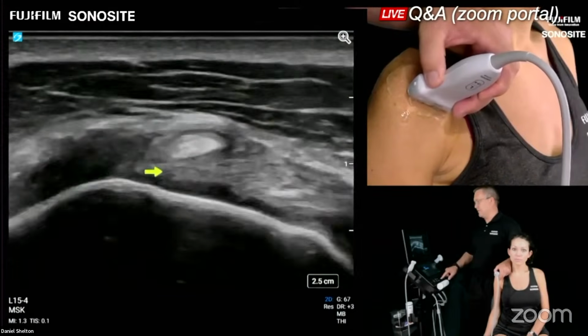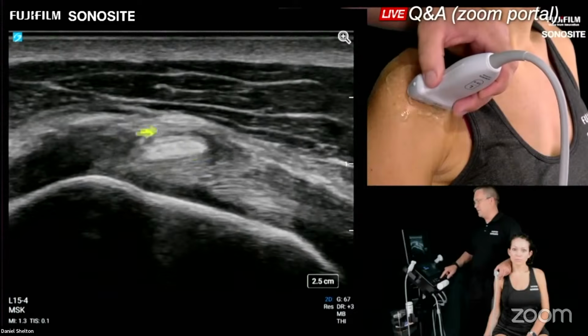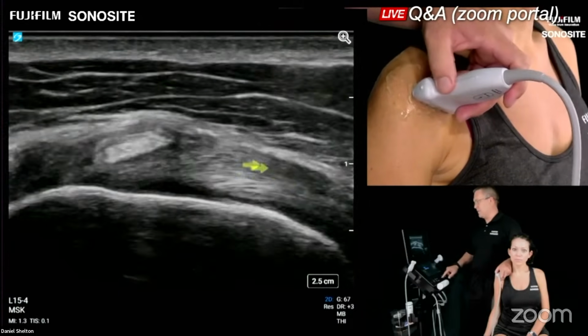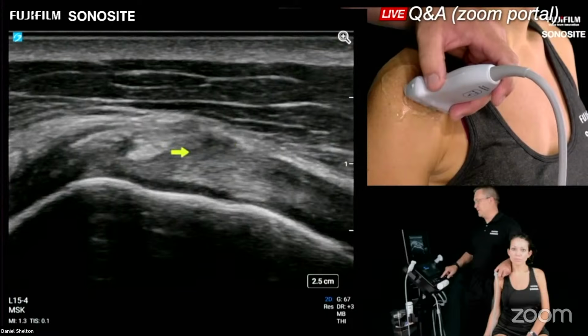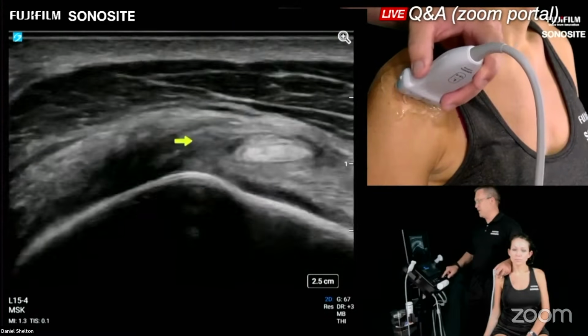There's clearly this directionality enveloping the top and bottom of the biceps. This is your rotator cuff interval. So by definition, we have the subscap here, the superior glenohumeral ligament here, and then we're going to see this sling of this complex of the coracohumeral ligament dragging over to the supraspinatus here.